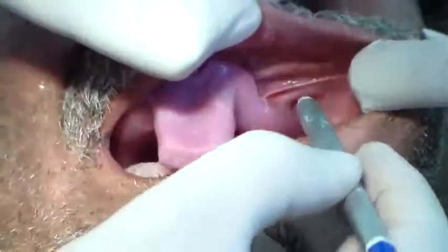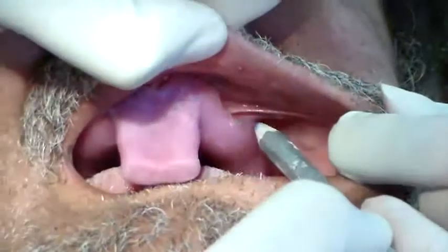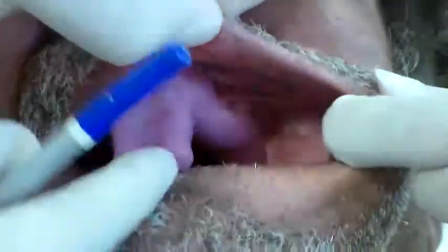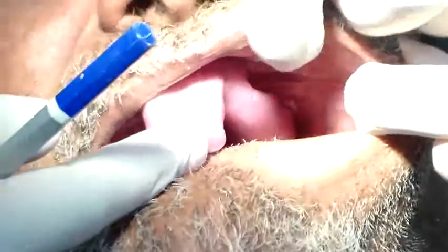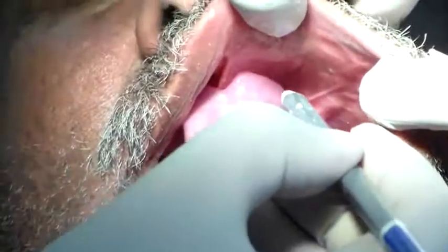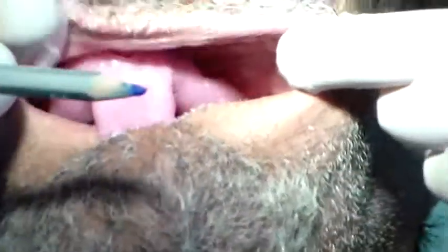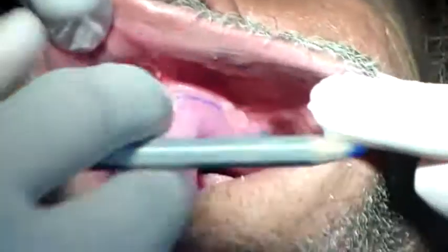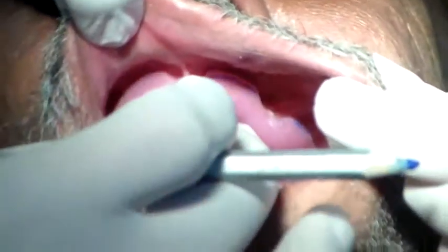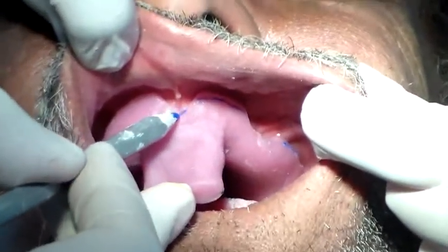So in this region, if you pull it up, it looks like there is space. If you pull it out a little bit, you see that it's contacting. So this region, maybe you want to reduce a little bit. Here also, in the anterior region, you see there is contact, so you want to reduce a little bit. The phrenum looks trapped. The base of the phrenum is actually here, and you see the base is trapped inside. So maybe you want to open it up a little bit here.